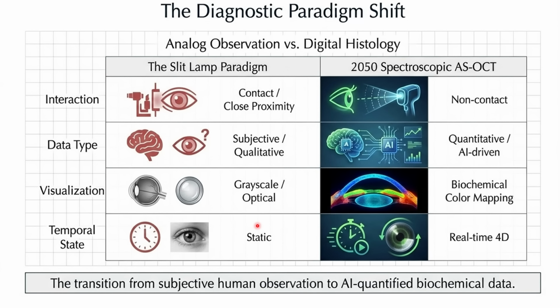However, when you look at the prospect for the anterior segment OCT, it is non-contact, so it will be portable in the future, and also with the integration of AI, the information becomes more quantitative, so that you can follow up your patient based on fixed data stored in the machine and see the improvement. For example, in uveitis, when we use the slit lamp, we used to scale the activity +1, +2, +3, based on the subjective interaction of the examiner. However, with the OCT, you can scale the severity of uveitis objectively and follow up your patient to see whether he improves or not.